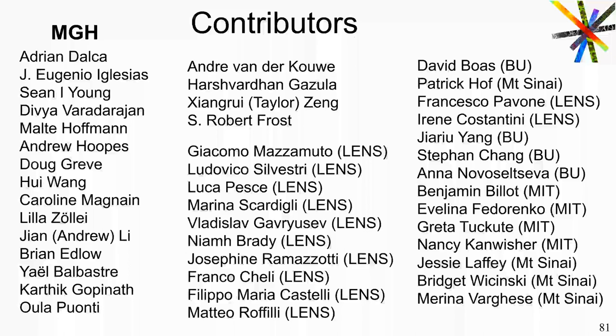Thank you for a very interesting talk. My understanding is that the axial resolution of OCT is limited by the bandwidth of the superluminescent diode. I thought that was typically on the order of 10 microns. It depends on how broadband your source is. So we use a very broadband source and we get to about 3 microns. I think the data I showed you was like 6 microns, and we're building one now that gets to 3. We're probably not going to get much better than 3. And the truth is the speckle noise is high enough that even if we get better than 3, it won't be very useful resolution.